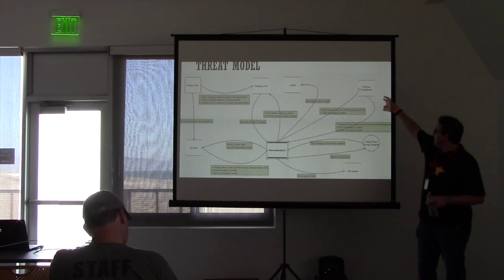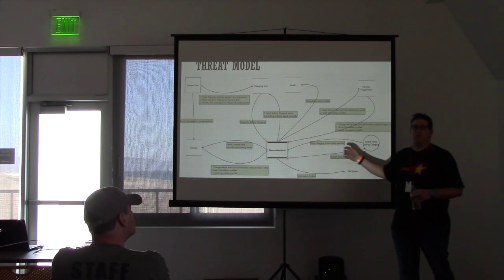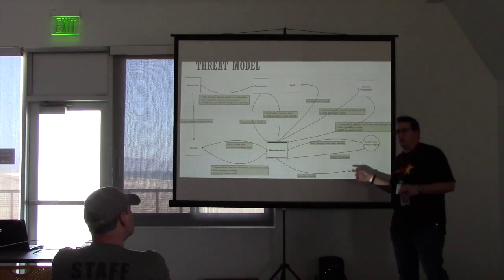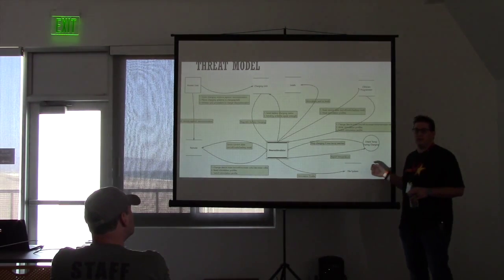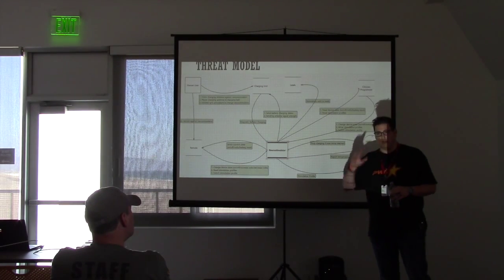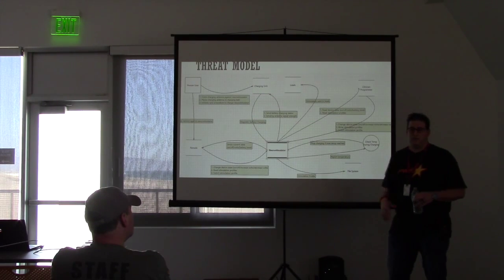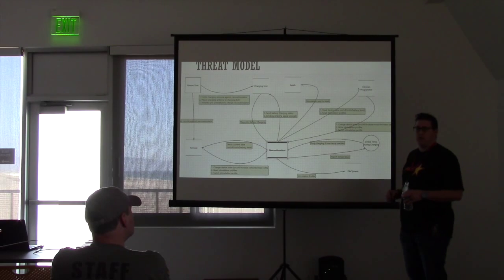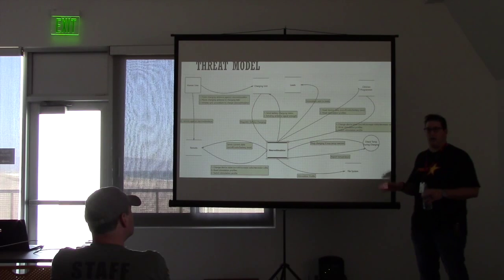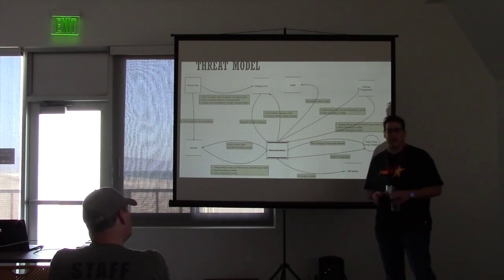So you've got the programmer, and then there's this lovely little feature here that, because of some of the other devices that have problems, actually looks for the device overheating. So it actually constantly checks the temperature of the device, and it will shut it down immediately if it overheats. So if for some reason the battery charging gets to a point where the skin heats up, and that has happened, if she lays on the device too much, it stops charging, and then she has to wait and charge later when the skin cools down. And when I say hot, I mean hot to the touch, where you can literally burn your hand on her back.